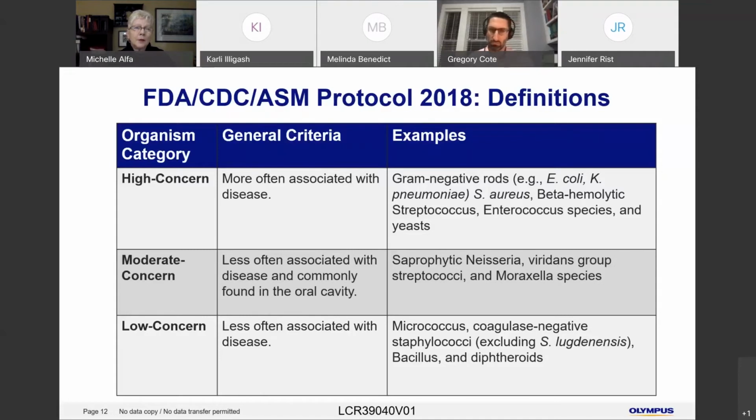And keep in mind, a lot of the outbreaks that have happened, most of them have been associated with multi-drug resistant organisms in the endoscope, and the same organism was shown in a patient that either got colonized or infected with that exact same strain of organism. This is as opposed to endogenous infection, where the patient's own E. coli is causing an infection, versus contamination from the endoscope.